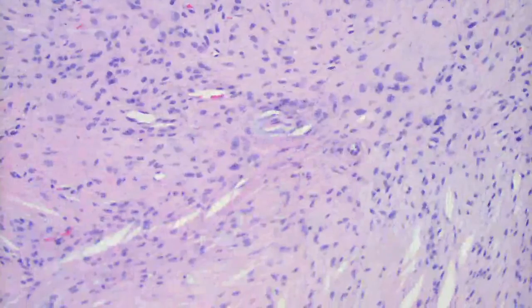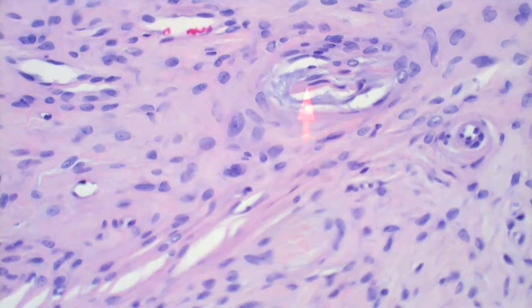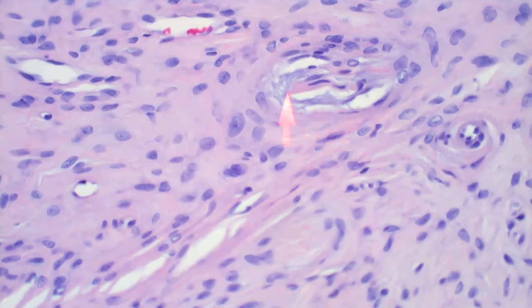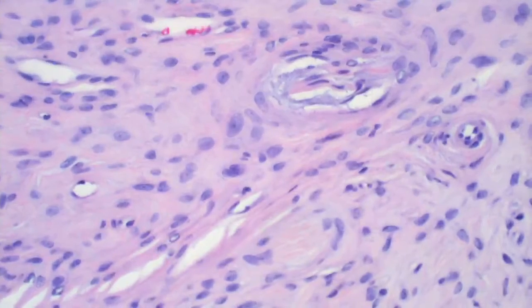Perineurioma, why is it called perineurioma? I'll pass to Gina on that one. So what's this I'm pointing at right here? Isn't that a little nerve right there? Yeah, it's probably a Schwann cell on the outside, so it's probably a little axon. So these cells out here are the perineurium, around the nerve, not the endoneurium. These are around the nerve, and this is what this lesion is comprised of. It's a nice example of a little nerve twig that's left, and these cells are all developing around this thing.